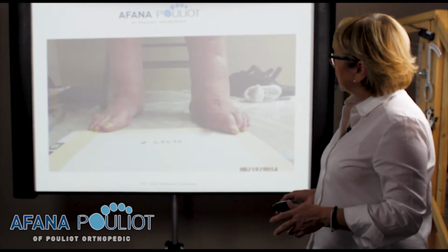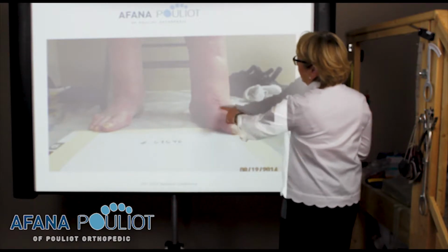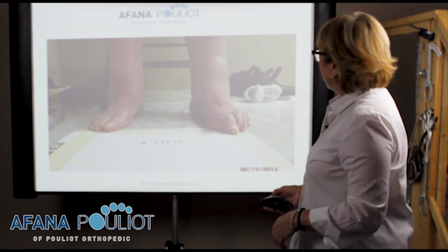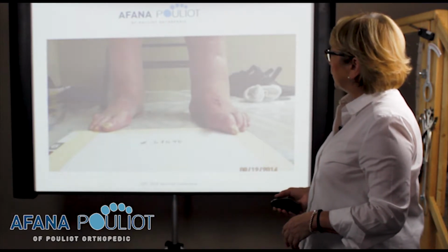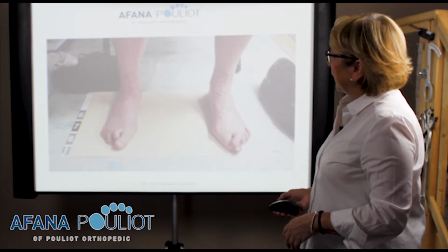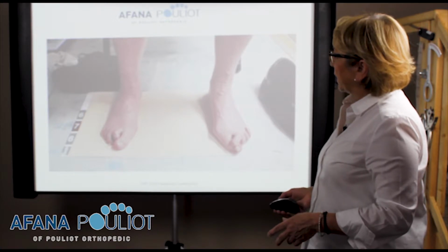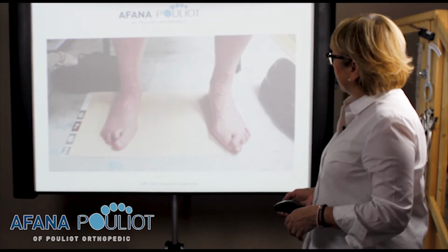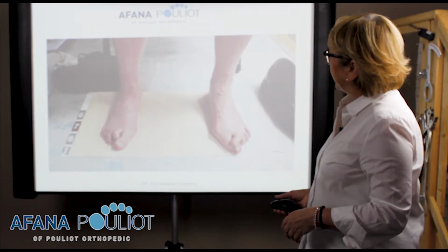Again, severe toe deformity. This patient had some surgery, and the sensitivity of the foot made it very difficult for him to find footwear that was suitable. Again, toe deformities, modified footwear, albeit there were still some calluses. As you see on the big toes, the nails were highly affected. So custom-made footwear here was totally indicated.